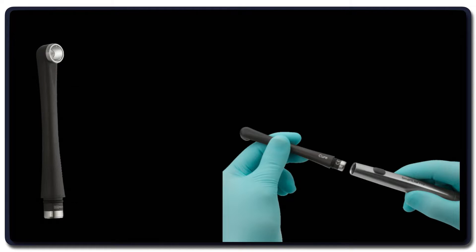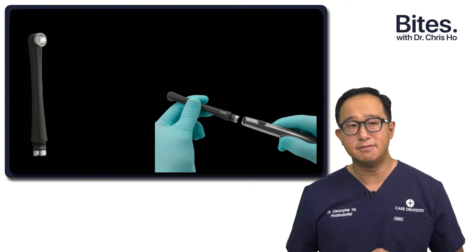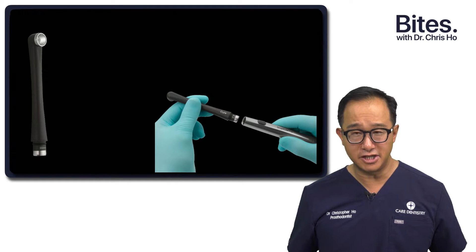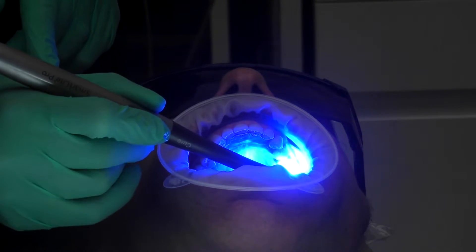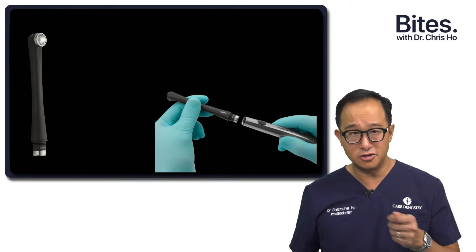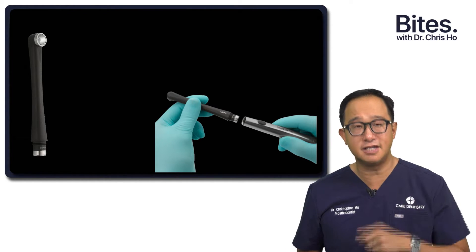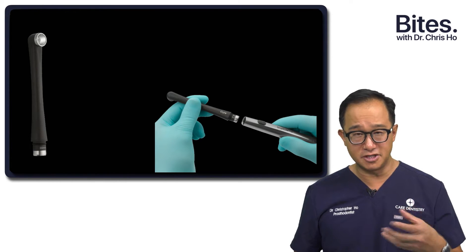So what makes this curing light different? Well, firstly, the actual light guide has a very large diameter tip, about 10 millimeters in diameter. A lot of tips are actually from 6 to 9 millimeters. So having a larger tip means that you can cure the composite restoration or your adhesive bonds in a much more effective way. You don't have to move the curing light around so much. And sometimes your nurse may be holding the curing light and possibly missing that area. So having a larger tip means that you have a better chance of polymerizing that composite or adhesive bond.